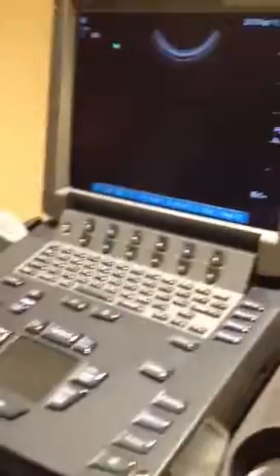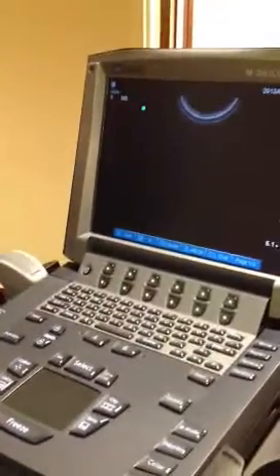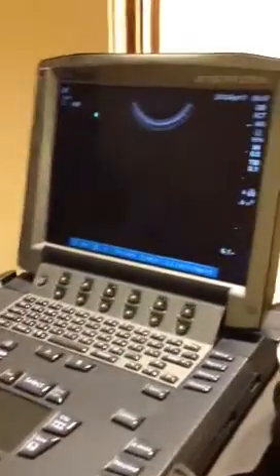Other than that, that's pretty much it for the system. It's really easy to use. It's fairly similar to the other one, it's just a way more robust engine. The imaging part of it is really a lot better. The printer is exactly the same. You won't have to turn it on every time. We'll just leave it on.